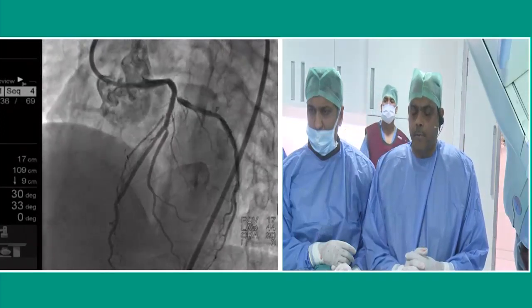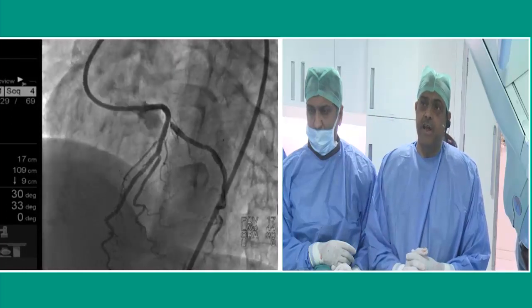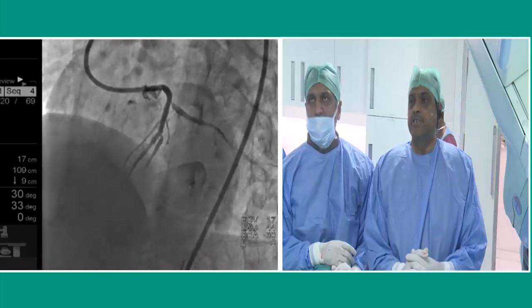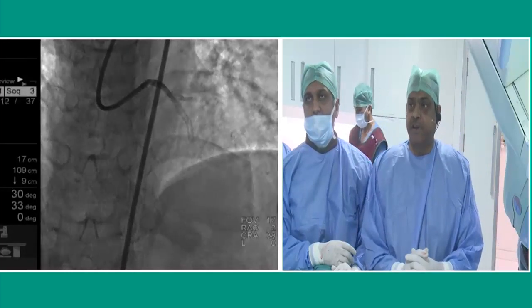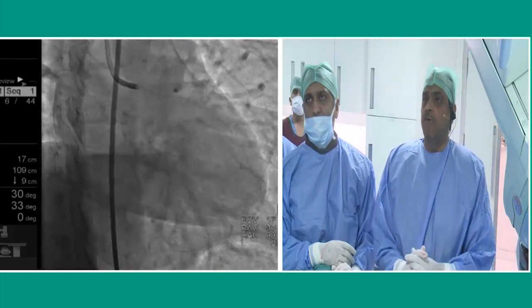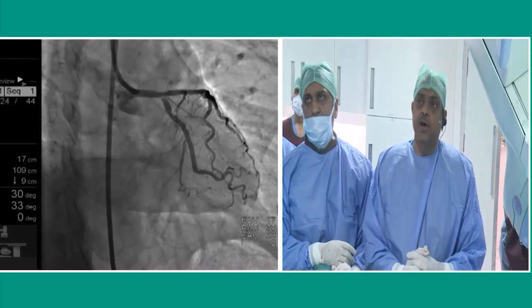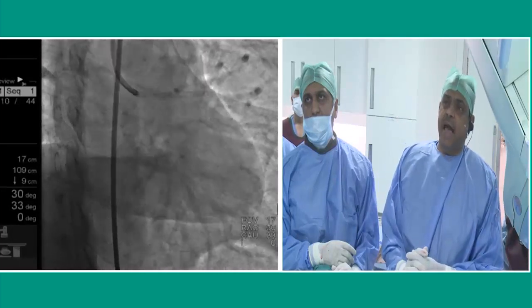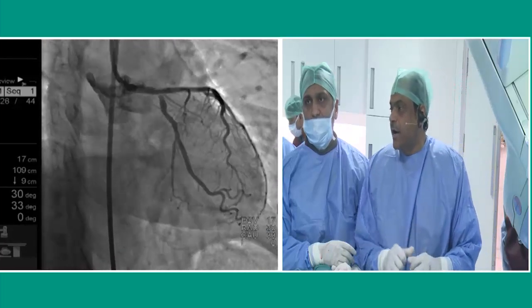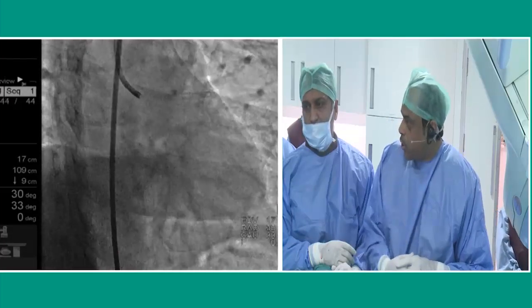Yeah, it's a stented artery. There is a mild disease in the left main to LAD, which doesn't look angiographically significant. Now our plan is to put 2 wires. We have already one. Then do an OCT to better define the lesions and the circumflex. We have an expert and we have recorded this OCT just now and he'll explain to you. Over to you, Dr. G.